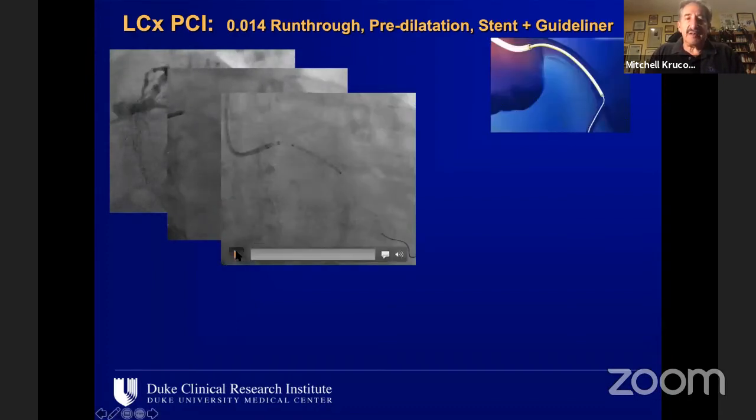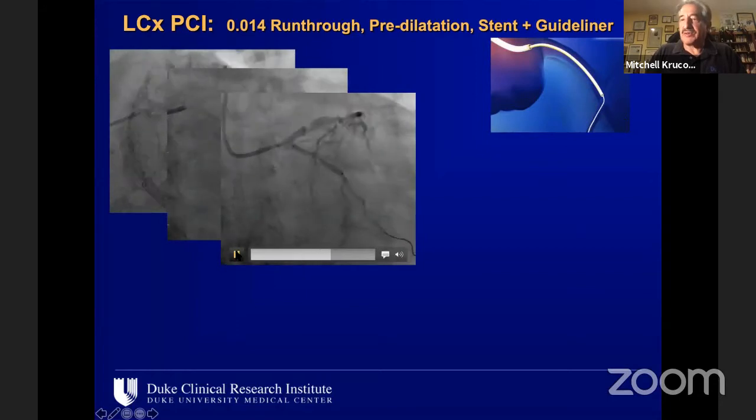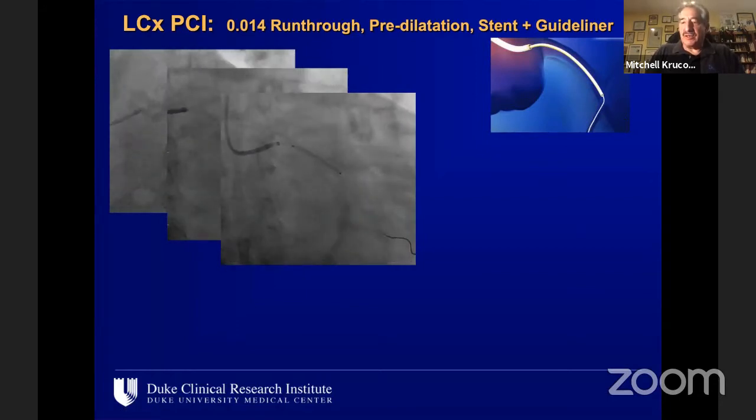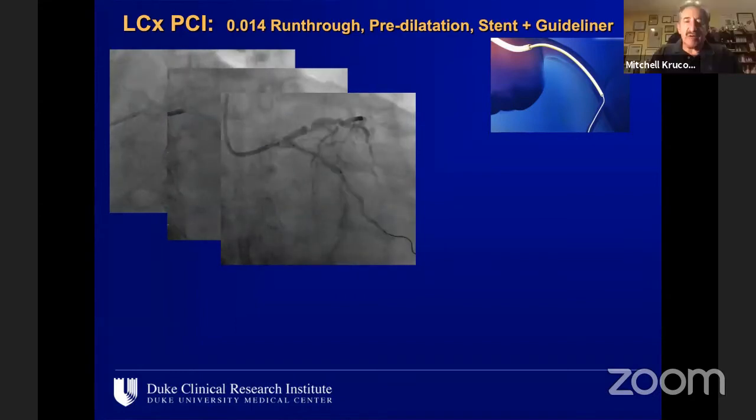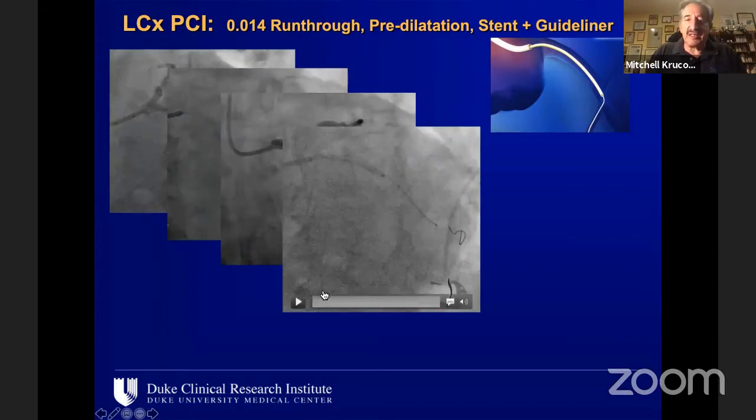And putting a stent down there, on the other hand, was a different story. So in fact, we were unable to advance a stent beyond where you see this one placed. So we put a stent here, first size, this is a 28 30 Alpine that we placed proximally with the hope that that would help us get distally, but it did not.